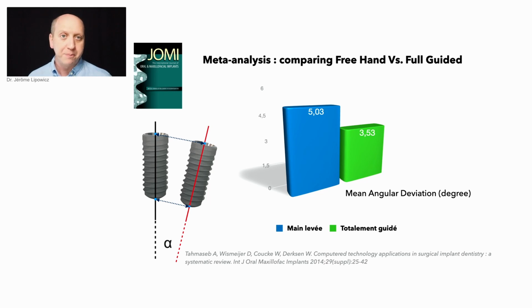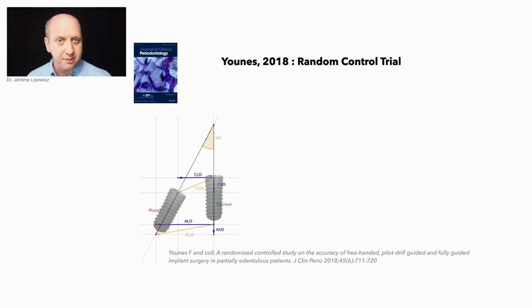It seems nothing, but depending on the length of the implants, but also the height of the crown above, the repercussion of this 1.5 degrees can be very catastrophic for the final prosthetic outcome and for its position, for the screw channel, whatever. So beware. These figures, however small they may be, depending on the situations, can be very, very significant.